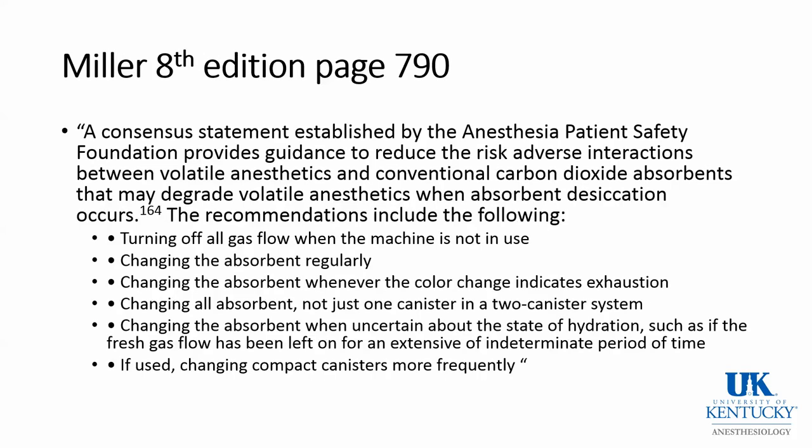So to summarize, the guidance for the prevention of adverse interactions between volatile agents and absorbents, I have cut and pasted this small paragraph from Miller's 8th edition, and as you can see, it's recommended that when the machine is not in use, all gas flow be turned off.